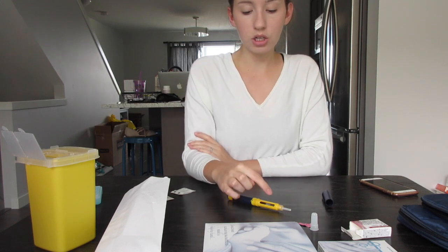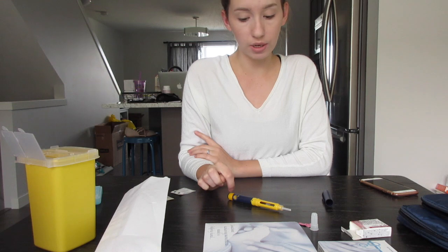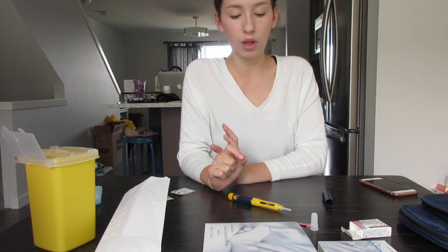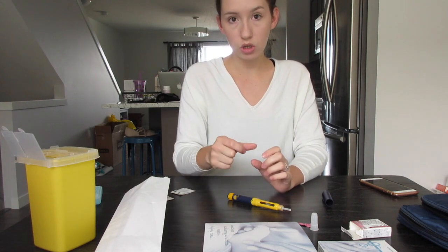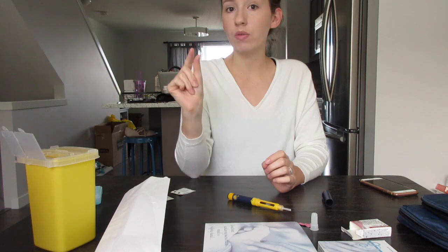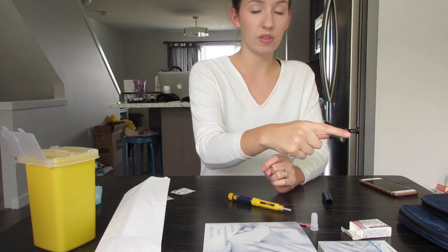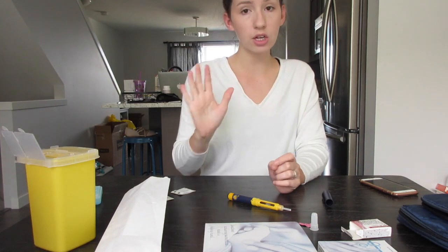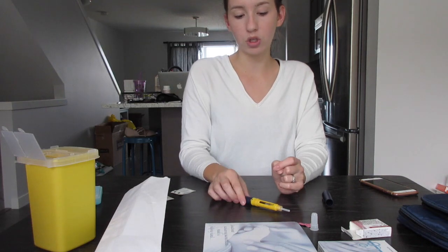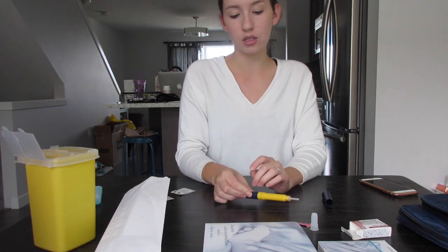If your cartridge is going to be empty before you fill the full units, this pen does the math for you. So you will still put it to your dosage. You will use it and then take it out. And whatever the number in the window is left is what you need to administer with the next cartridge. So you don't have to touch it. You just change the cartridge and then you continue pressing, which was tricky for me at first, but once you get the hang of it, it's really convenient.